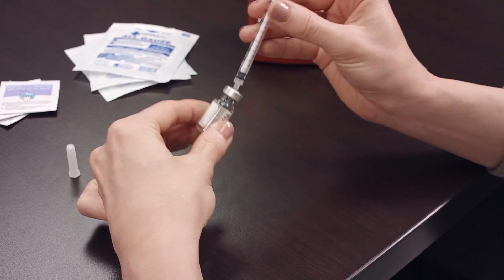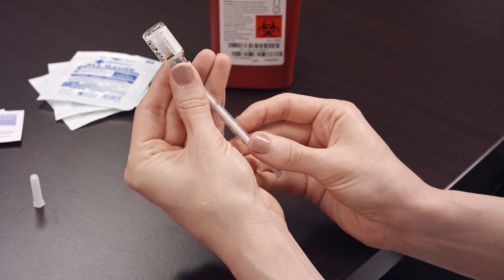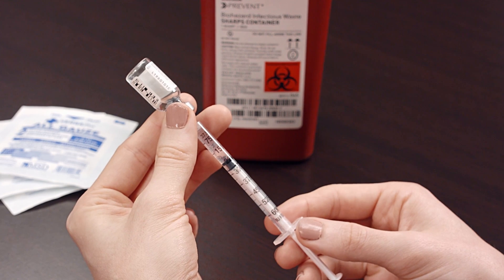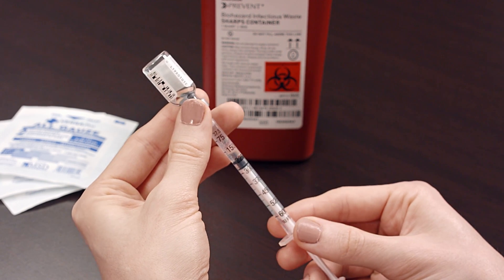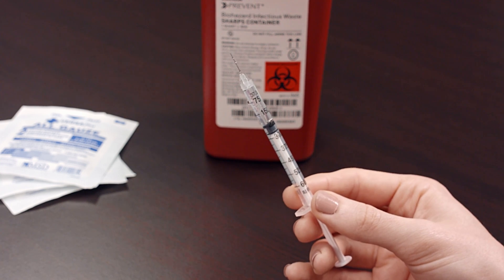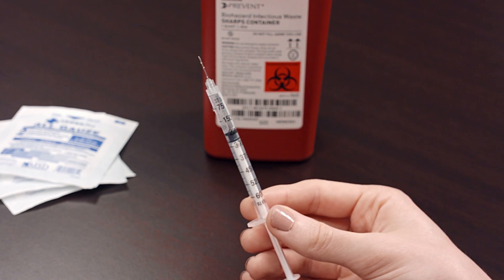Invert the vial that is attached to the needle and syringe, and pull the plunger while keeping the tip of the needle submerged. When the plunger is filled with the correct dosage, remove the needle from the vial holding it upright. Don't let the needle touch anything, including your hands.